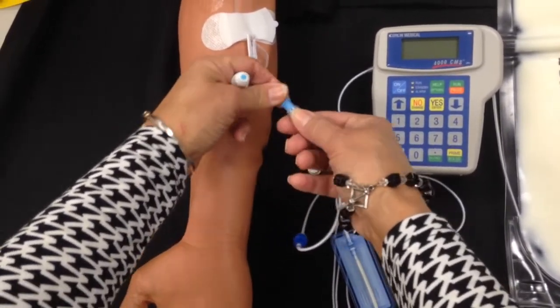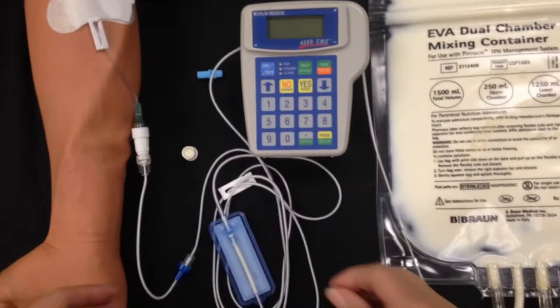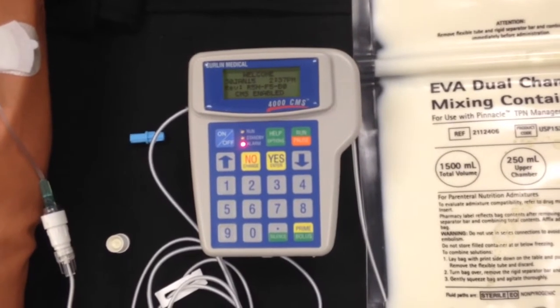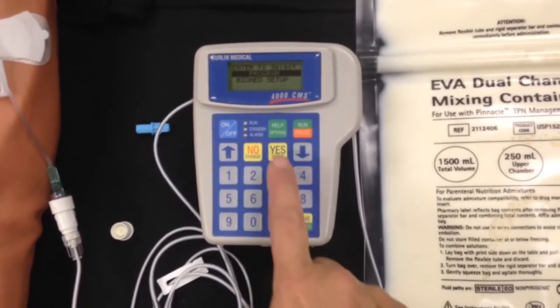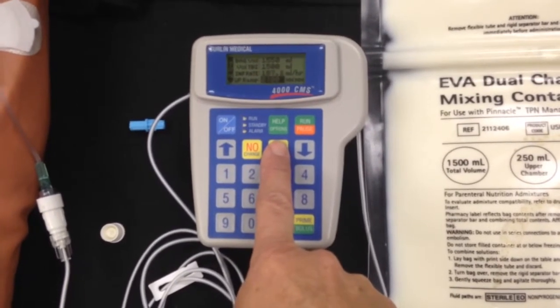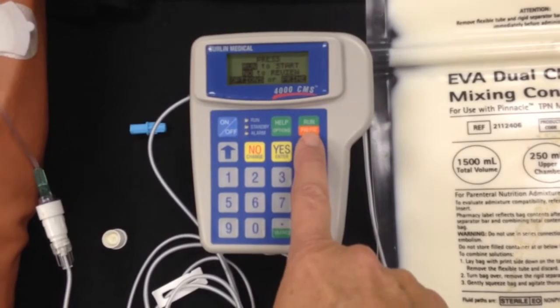So now you're ready to remove the cap from the tubing, line these two up, push and twist. Okay, turn the pump on. Check your battery to make sure you have a full battery. We're going to say yes to program, yes to repeat RX, and we're ready to push the run button, which is in the upper corner, to start.